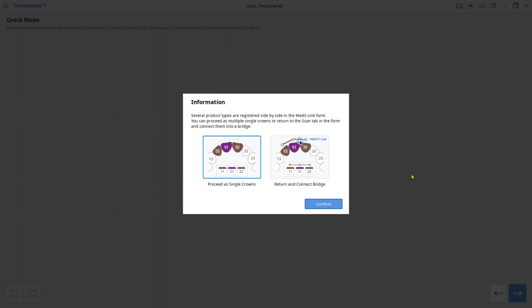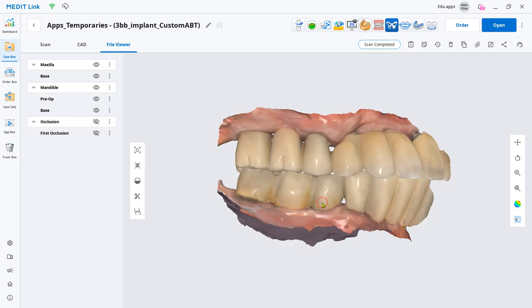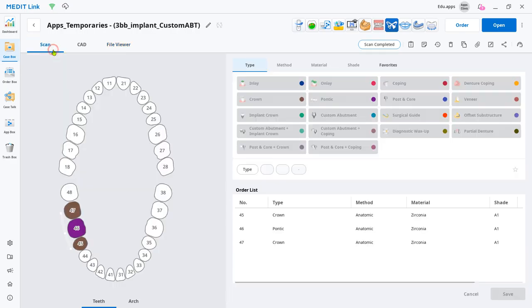If you try to design a temporary bridge and forgot to connect teeth together in the form, you'll get this pop-up that gives you an option to go back and correct your form or proceed as all singles.